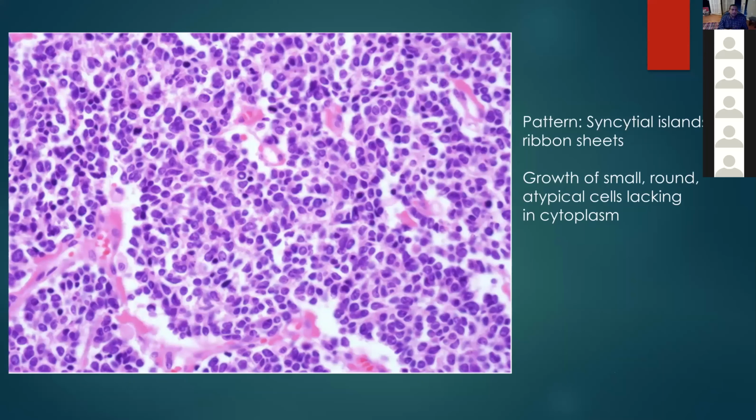So to the uninitiated or a non-pathologist, if I asked you to describe this, what would a typical non-pathologist say? Oh, I see a lot of blue stuff, maybe a little bit of purple, and the rest of it is pink. And the background looks empty, looks like air. So what was the main thing you see? I see a lot of blue. That means it's a round blue cell malignancy. Even in this slide from a publication, you can pick up mitoses, or apoptosis.